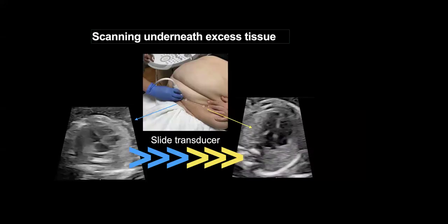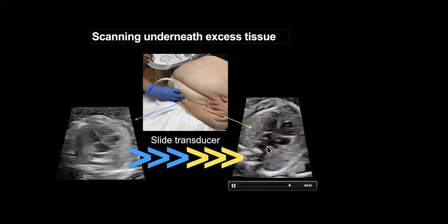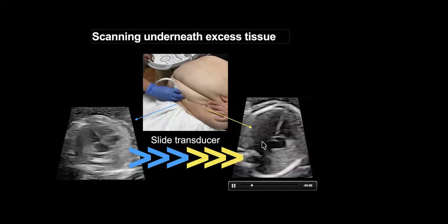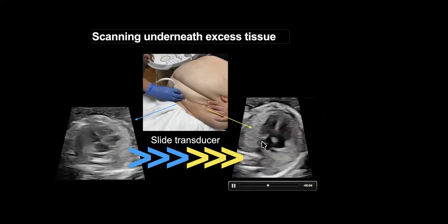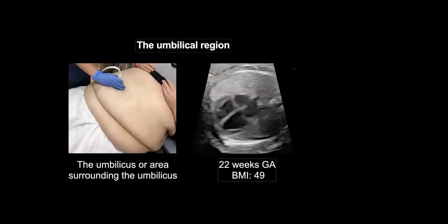And here you could actually see, this is the same patient, where you could see there is truly a right and left heart. As well, you could actually appreciate the Coumadin ridge that you can see within the left atrium. So utilizing just different maternal planes, utilize the maternal abdomen to really get the views that are needed.